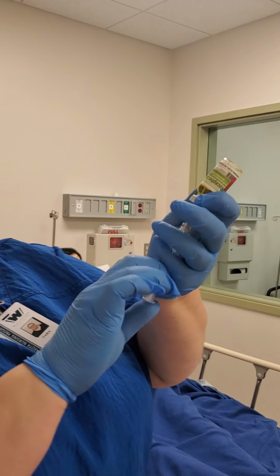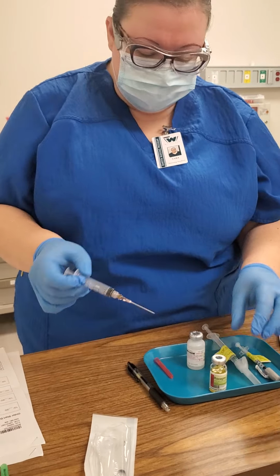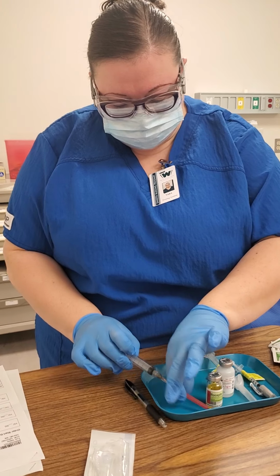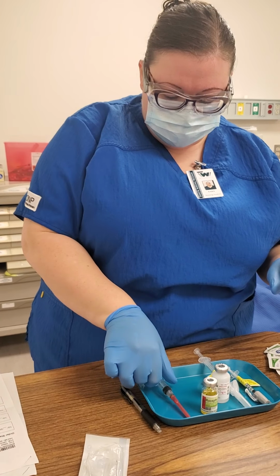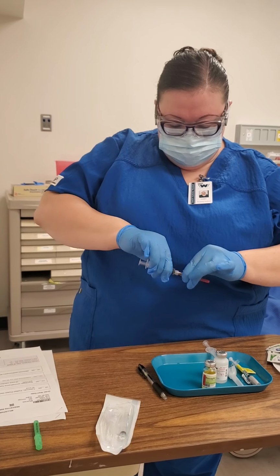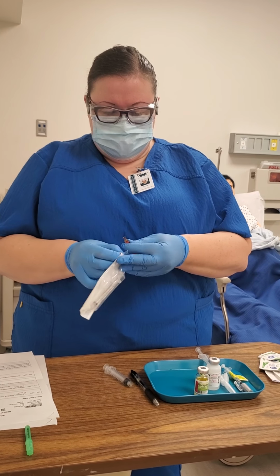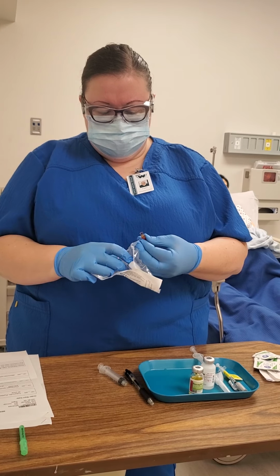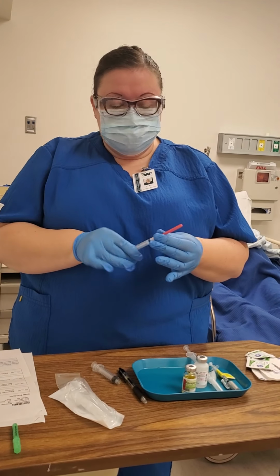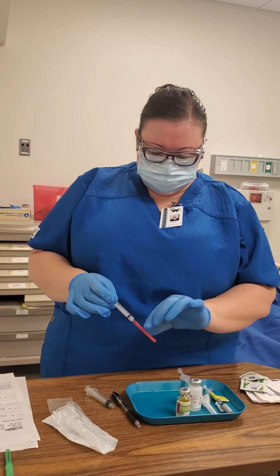Oh, you know what? I'm doing this wrong. I have to switch my needles first. So I'm going to take my needle off of here and put it on this one. Put it on the wrong one. And I did my dimensional analysis on this, so I know that I have to draw out 0.5 milliliters of solution.